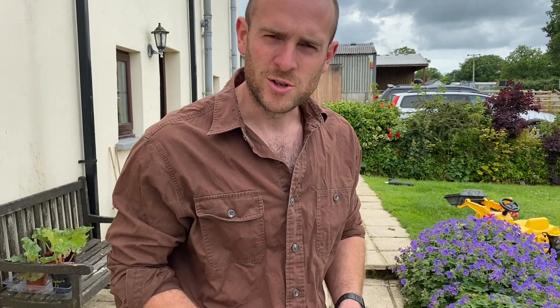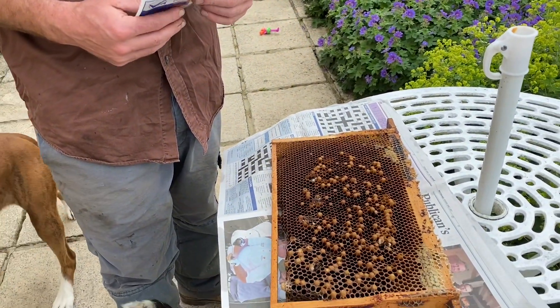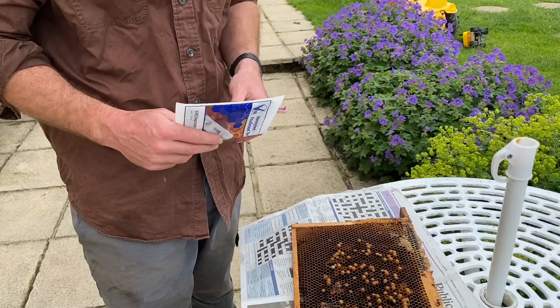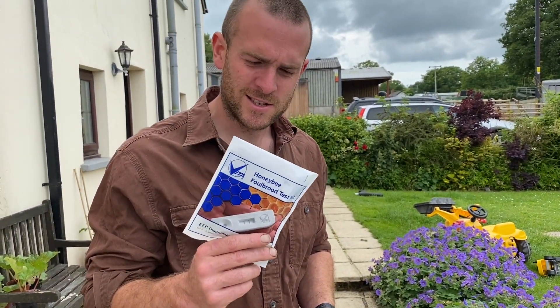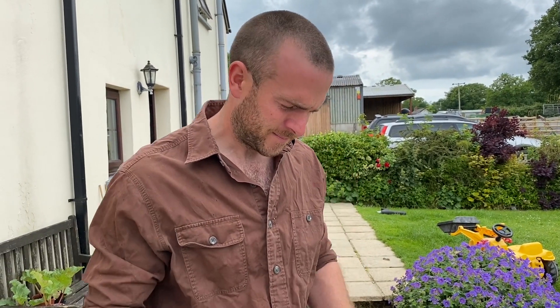Today I just went through some bees and found a dodgy frame in one hive. I'm 90% confident it's not fowl brood, but I am going to test it. I've got the kit here and this is a great opportunity to show you how to use these tests. Normally I carry these in the truck, but today I didn't have it.